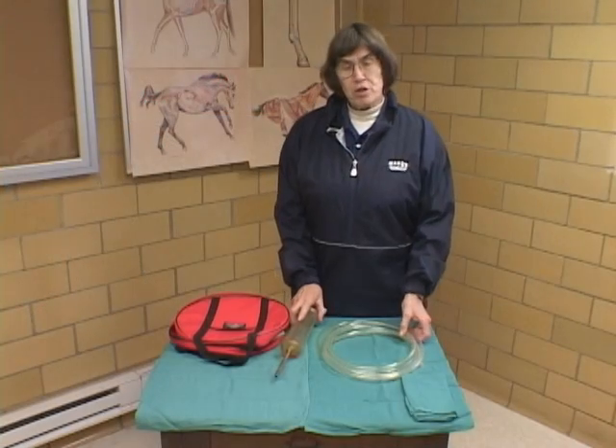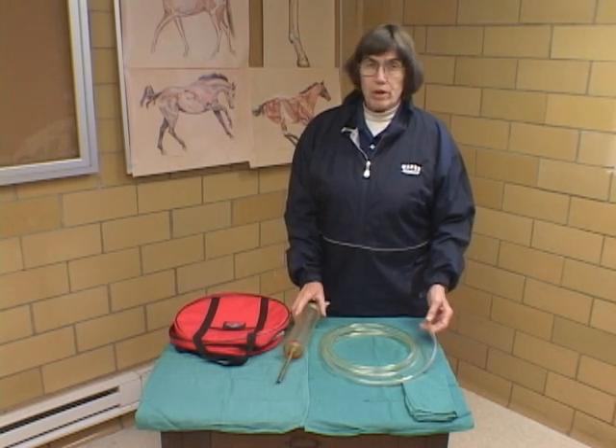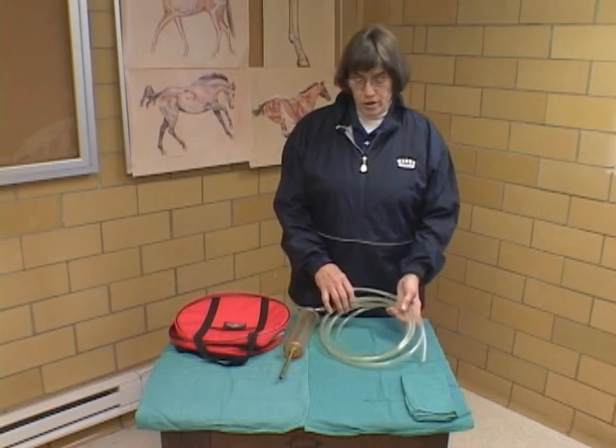The next method of administration we want to show you is administering medications through a nasogastric tube. This is another way that we're going to be administering oral medications to the horse, usually when we're administering a large quantity.